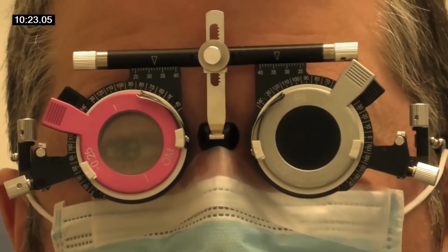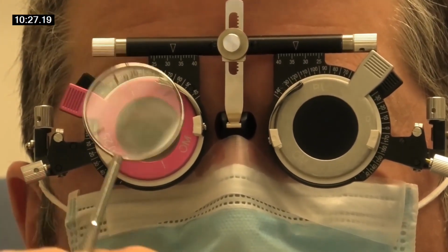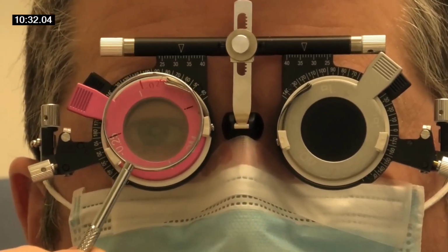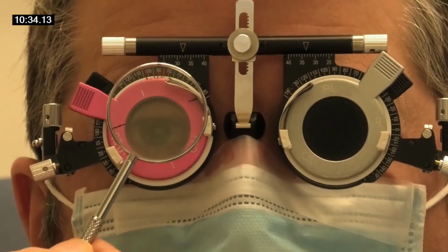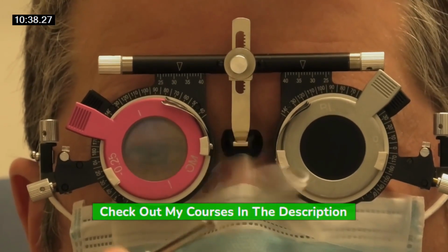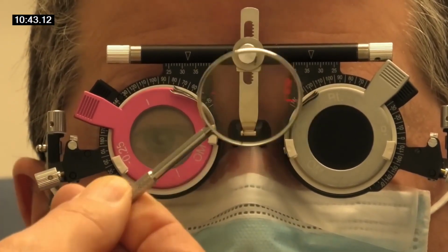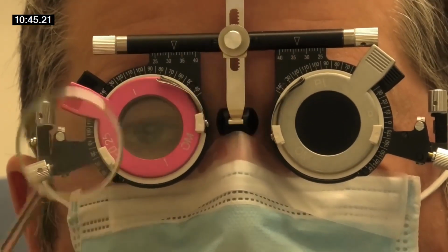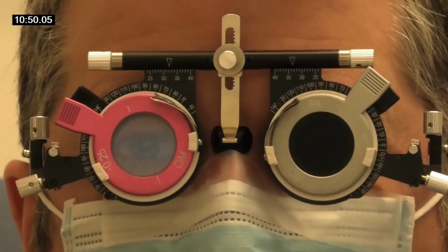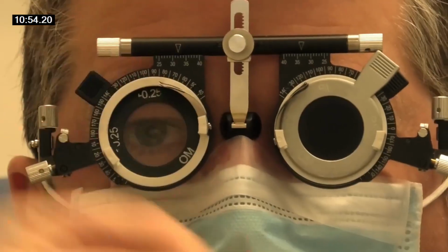So there's no cylinder. But it's hard when you're learning, because you're going like this and like this and all that sort of stuff, as you can see. But actually, that's how it's supposed to be. I'm squeezing it quite hard here, because I was holding at the end as well. I'm squeezing it quite hard to get that sort of twist. And that is actually quite tricky, but after a time you do get good at it. It's just the thing. So we take that one out, we finish that one, there you go.